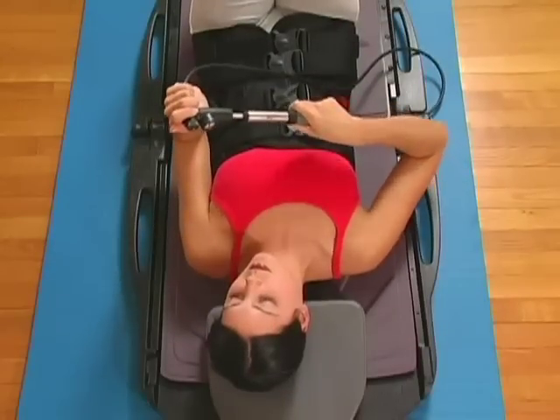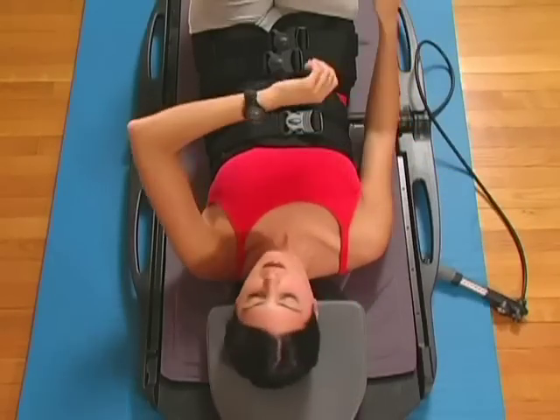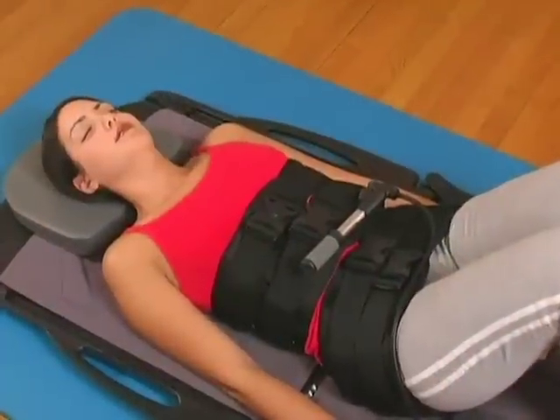After you have reached your recommended traction force, begin timing your treatment as prescribed by your health care provider. Be sure to lie still and relax during your treatment time.